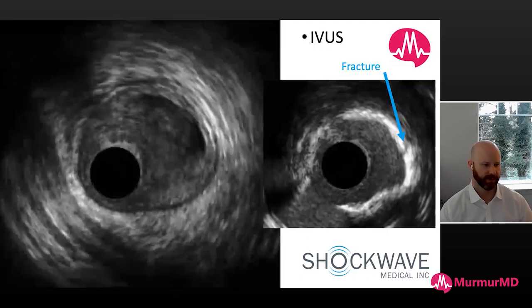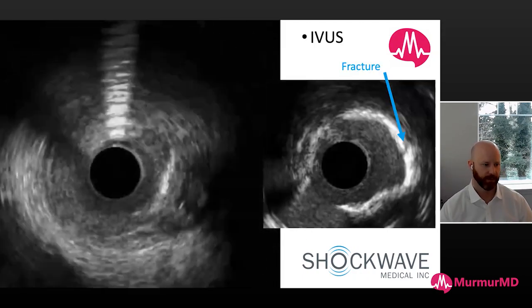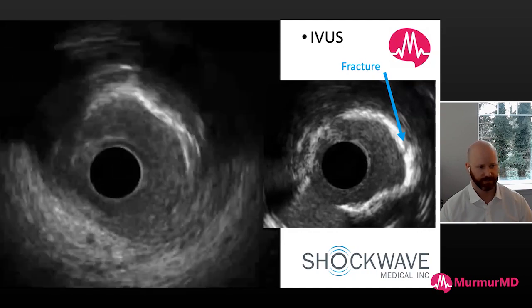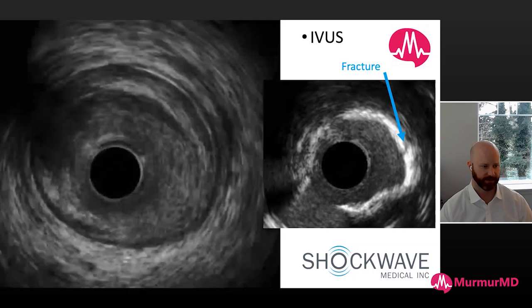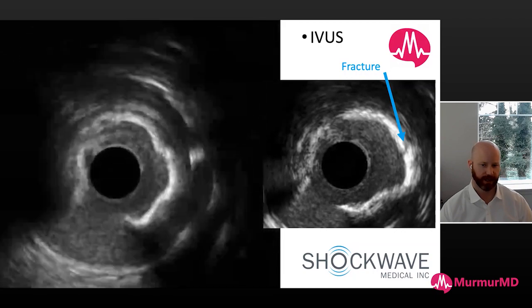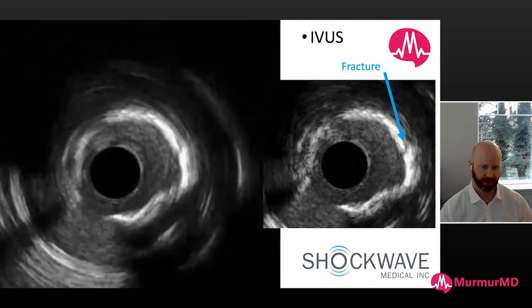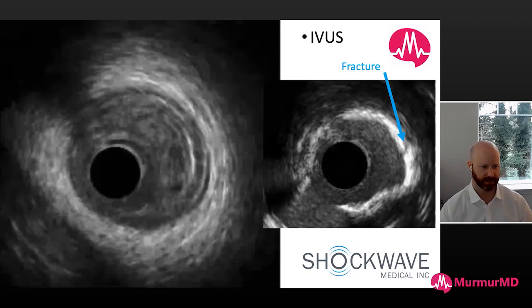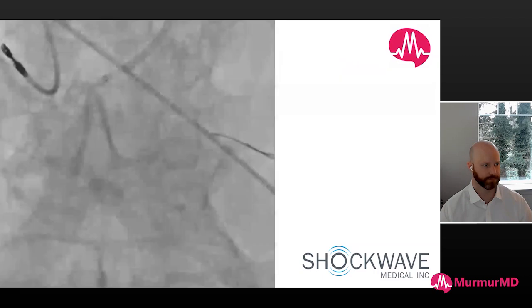And we then followed this with intravascular imaging. And what you'll be able to see here is there is a relatively long segment of circumferential calcium, which is well modified now with several fractures throughout. And in our cutout image here, you can see the large fracture in the very severe portion of calcium. This is in the area where the circumferential calcium was most difficult to expand.